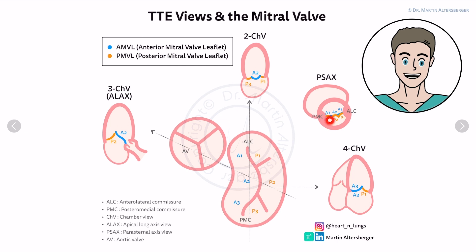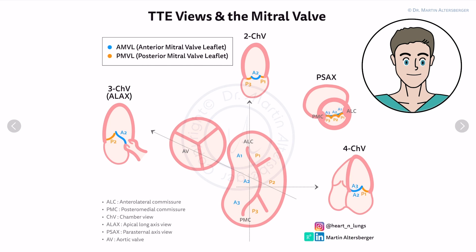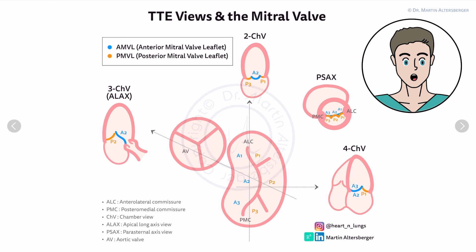You can probably see where mitral regurgitation is originating. Furthermore, you can measure the opening of the mitral valve in the parasternal short axis in cases of mitral stenosis.